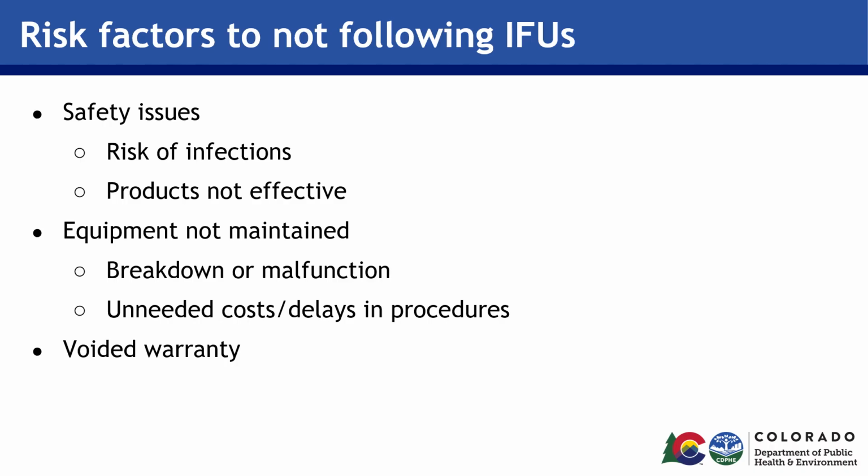For example, a staff member uses an approved surface disinfectant wipe to clean a shared medical device, such as a blood pressure cuff or a glucometer, between patient or resident. The disinfectant IFU states that the surface needs to remain visibly wet with the disinfectant for 4 minutes, which is the specified contact time to effectively kill common pathogens like C. difficile or MRSA. The problem is that the staff member, due to time constraints or a lack of training, quickly wipes the device and immediately puts it away, or uses it on the next patient or resident without allowing that surface to stay wet for the required 4 minutes.